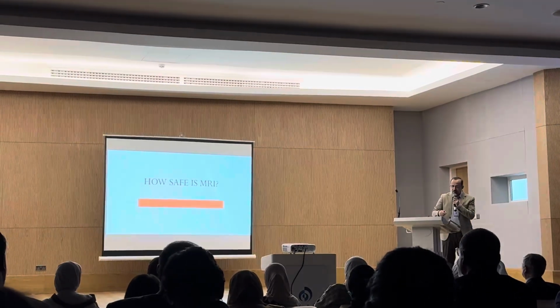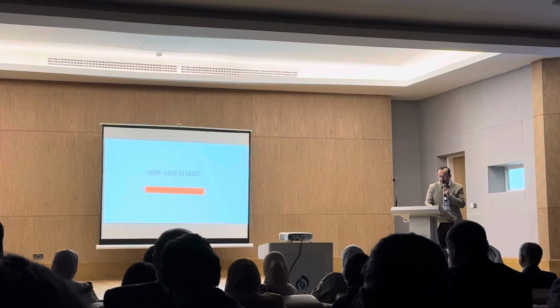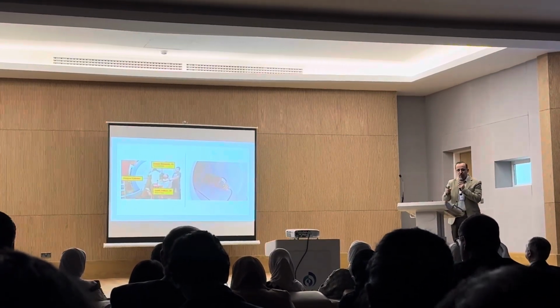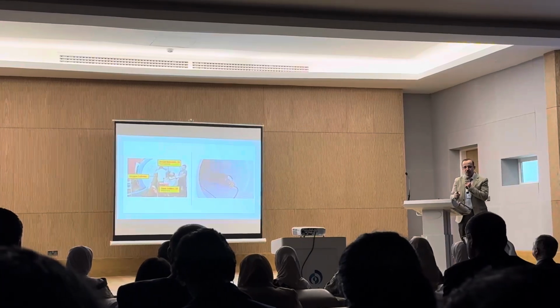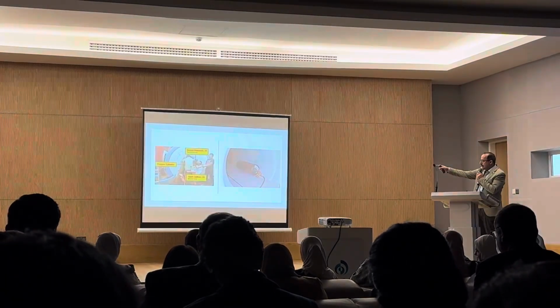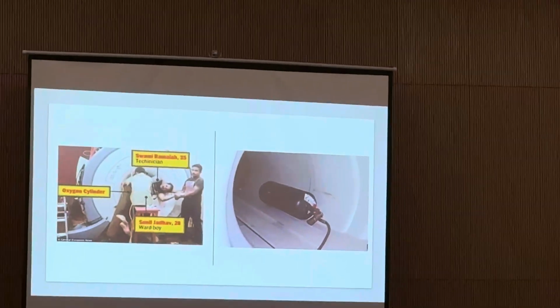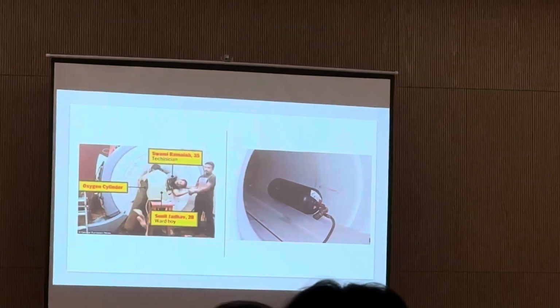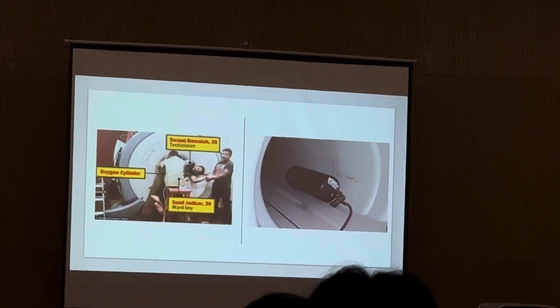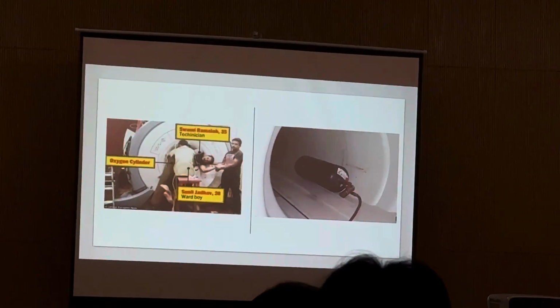Next question is, how safe is MRI? The answer for this question is by uploading these images. I upload these images from true life accidents through imaging of MRI patients. The first image is a pulled large oxygen cylinder which is squeezing and pressing the patient in the entry of the magnet bore, and the assistants and accompanying staff are trying hard to save him, which is not applicable.